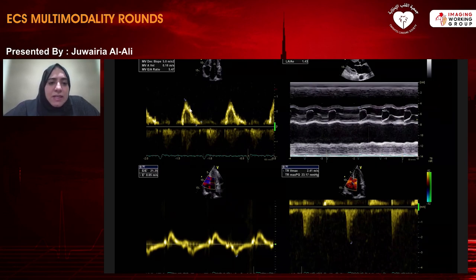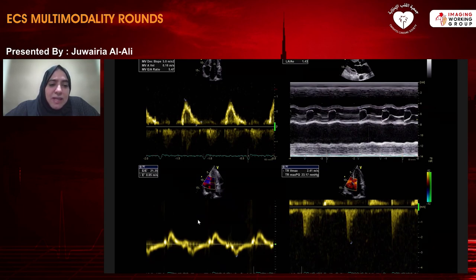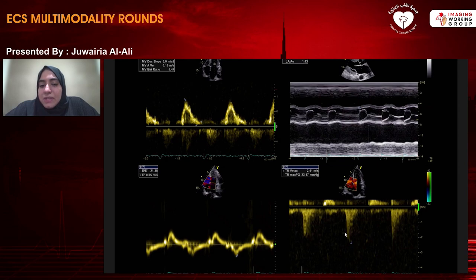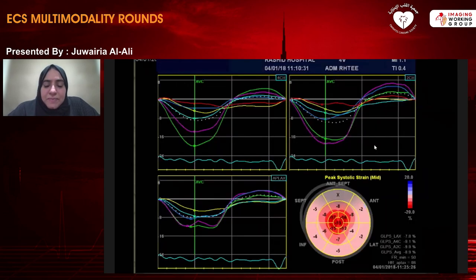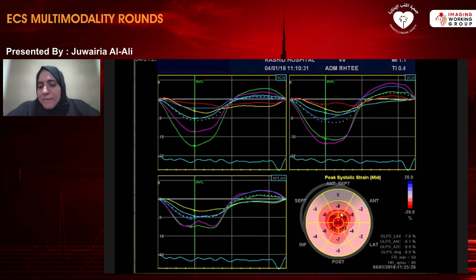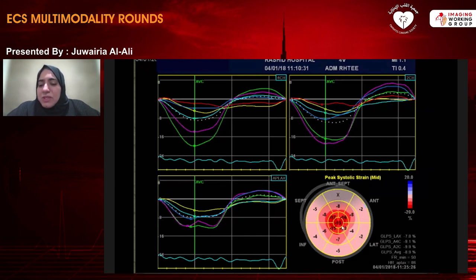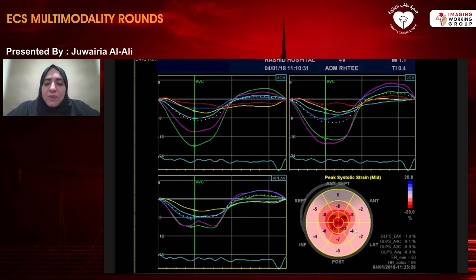His diastolic function assessment showed no A wave because he was in AF. His E velocity was 0.88, with a markedly elevated E to E prime ratio of 21. His TR velocity was 2.3 m/s. He had LA dilatation. On strain imaging, he showed preserved strain at the apex with reduced strain at the bases — what we call the cherry on top appearance. This led to a specific diagnosis: he underwent abdominal fat biopsy suggesting amyloidosis, followed by bone marrow biopsy confirming multiple myeloma.